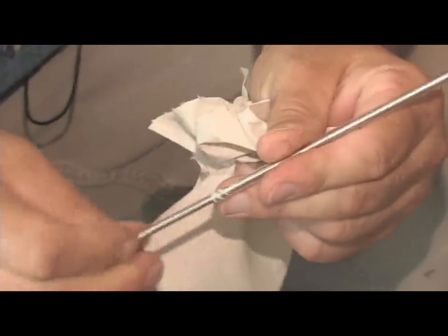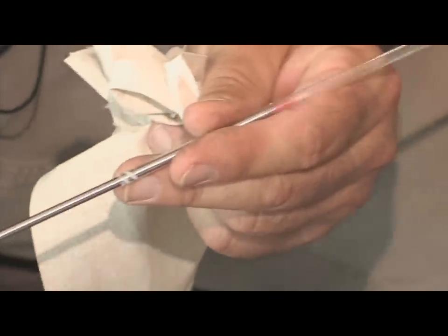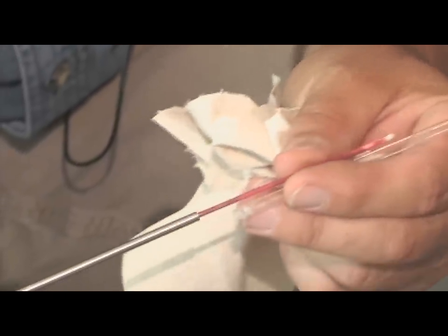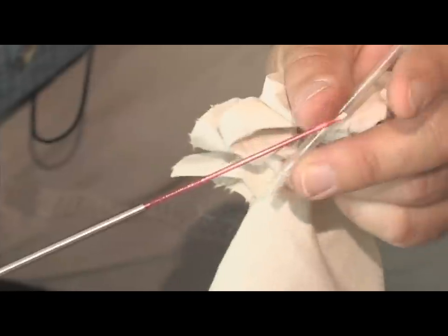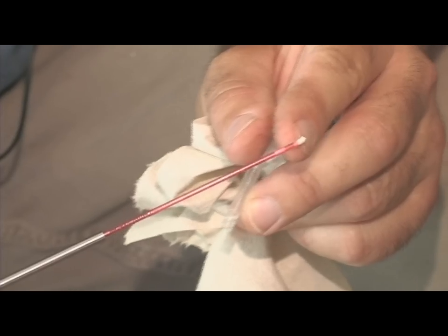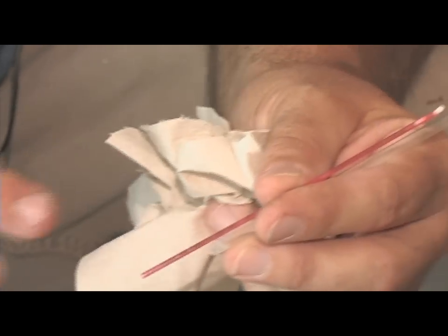Now the straw is all the way on the other end. It's right here like this — it comes out of the tank. One end's clamped off and they've heated it up and mashed it closed. It's sealed. The other end has these two little cloth-type corks on this side right here.